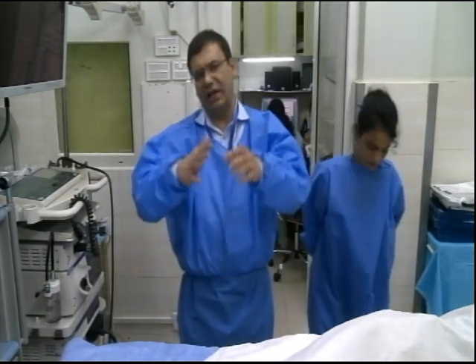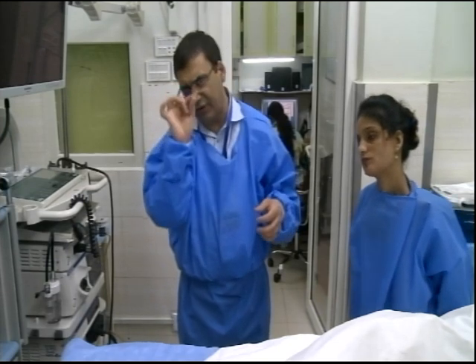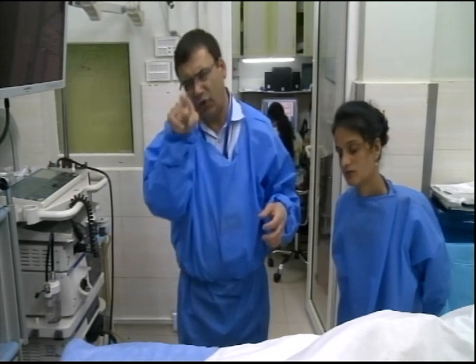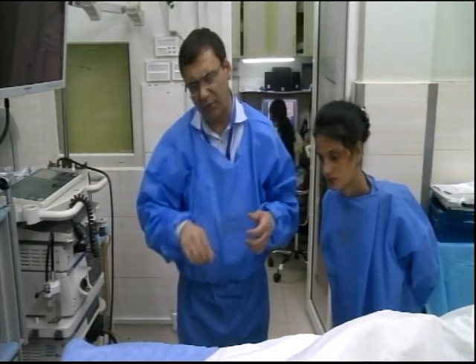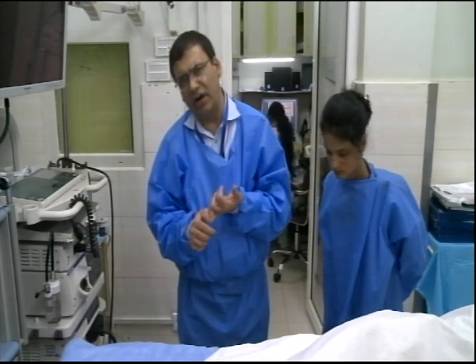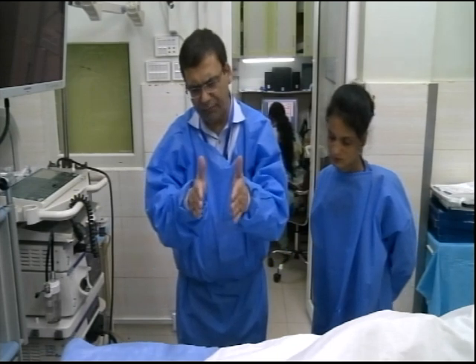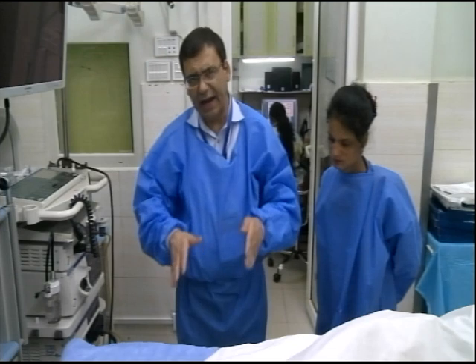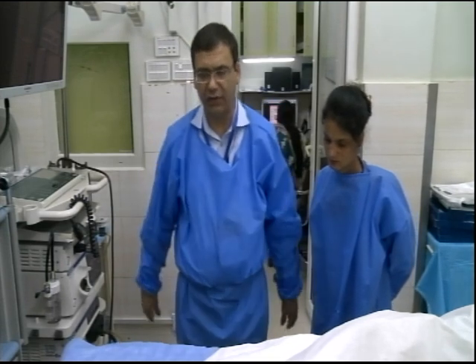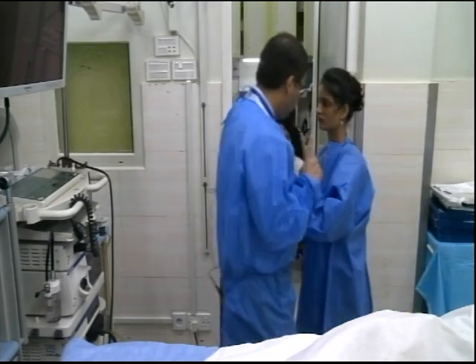It looks like a mass, like a big, huge lymph node. Just remember that you may possibly see in the center of it the urethra, or you may see a calcification in there as well. Because of the urine, you will probably be easily able to recognize that. Then you keep coming back, and you see the internal sphincter and external sphincter. So these are the structures you are looking at. You can also put some water in the rectum and inflate your balloon to approximate the EUS scope to the walls. So that's how you do the examination. Great. Thank you. I think we're going to go to the other room, right? They are ready?